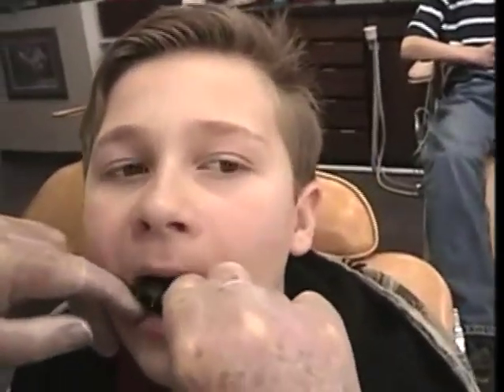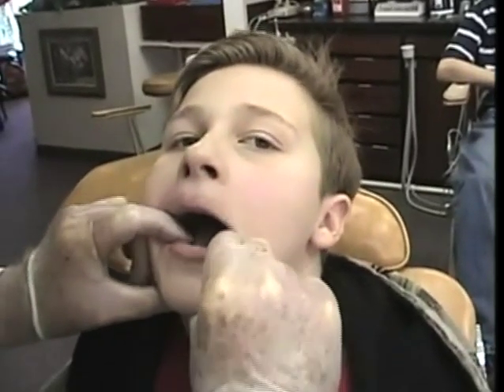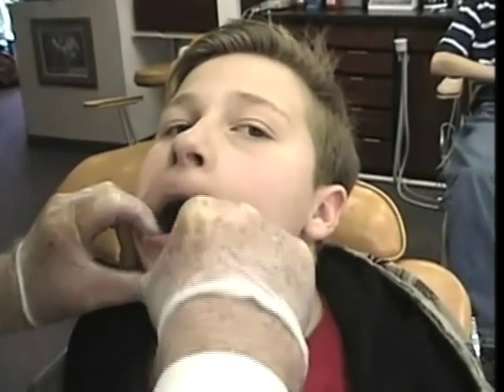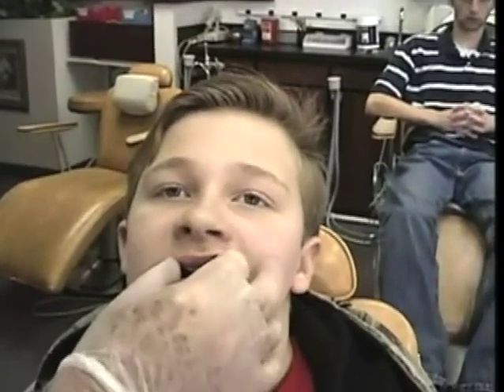Okay, we have adjusted the patient's appliance, and we are delivering it right now, fitting it to his bottom teeth. Okay, now how's that feel? Yeah, hitting even. Good. Okay, look in the camera.